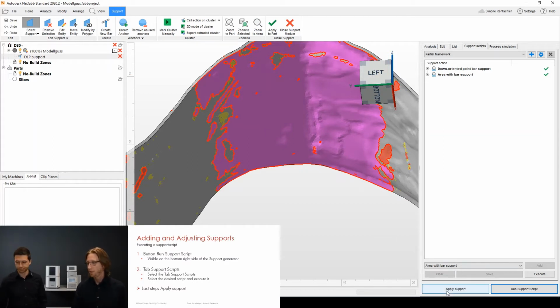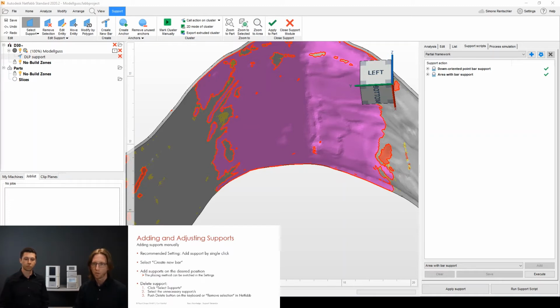So therefore we have the button apply support also in the lower right corner, and this way you go back from the support generator to the machine environment. All right, so the next step would be, let's just talk about adding supports manually. What we have already seen.